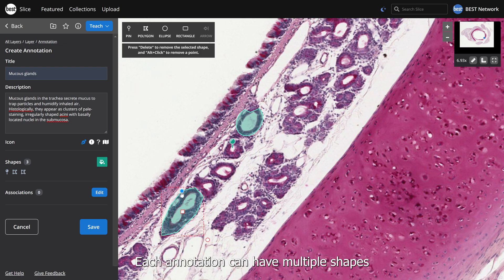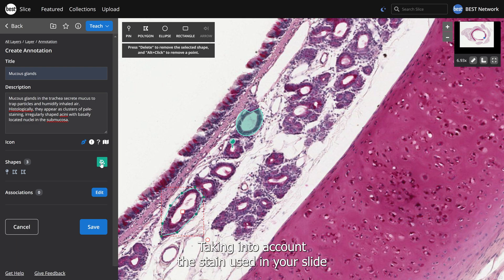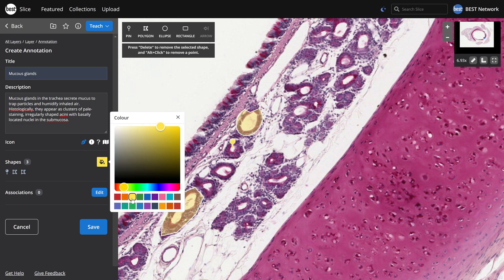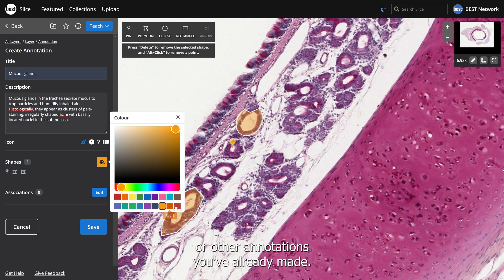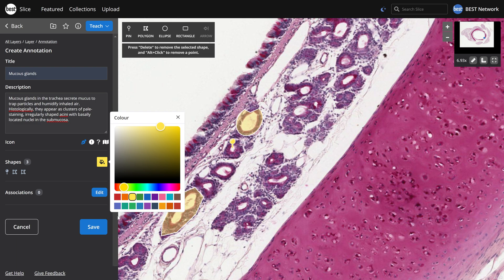Each annotation can have multiple shapes that mark out many examples. Choose a color for your annotation by clicking the paint tin button, taking into account the stain used in your slide or other annotations you've already made. Choose one of the 20 preset options or use the color picker to choose your own. Click Save.